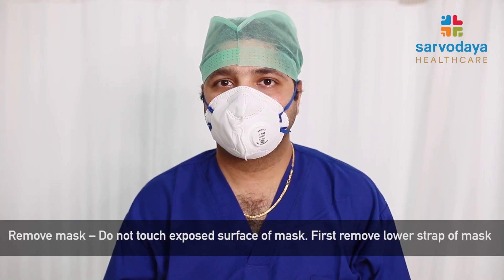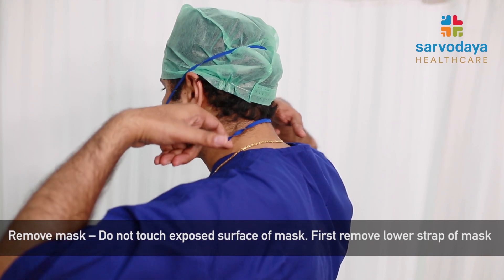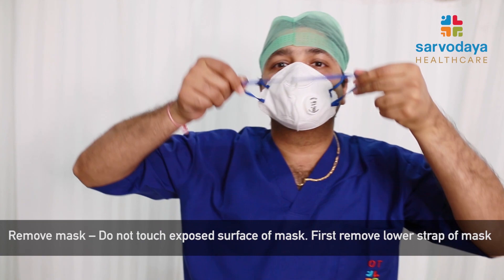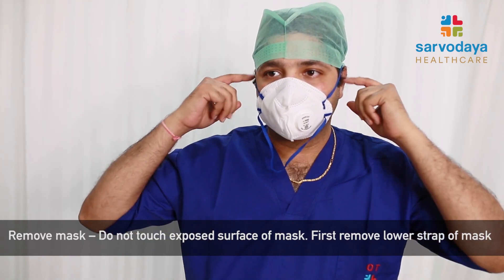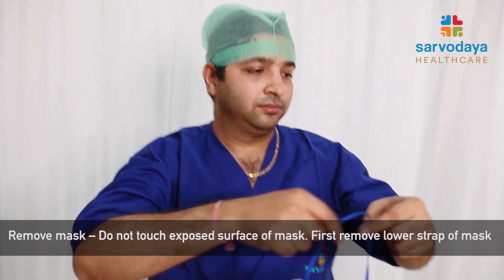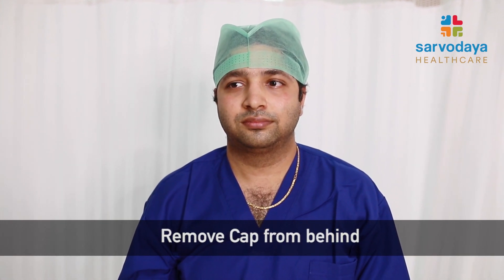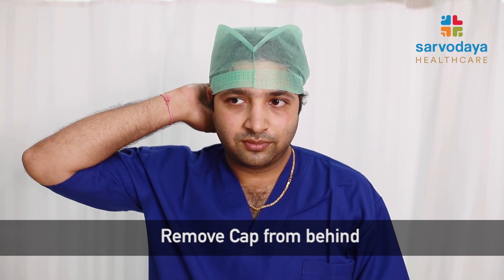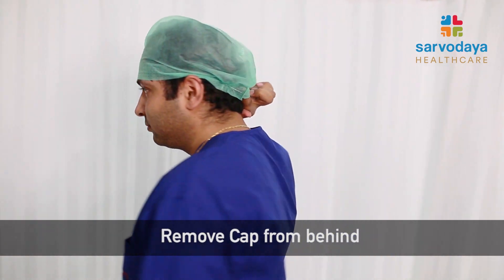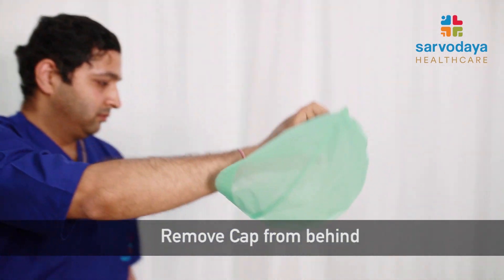Now we will be demonstrating how to remove the face mask. To remove the face mask, the lower strap should be removed first — pulled forward and to the side. Similarly, the other strap should be pulled and the mask should be directly put in the bin without touching any surface. After this, we need to remove the cap. To remove the cap, touch only the cap from behind, insert the finger, peel it off, and put it in the bin.